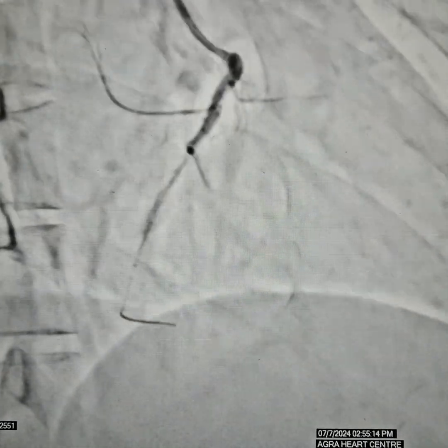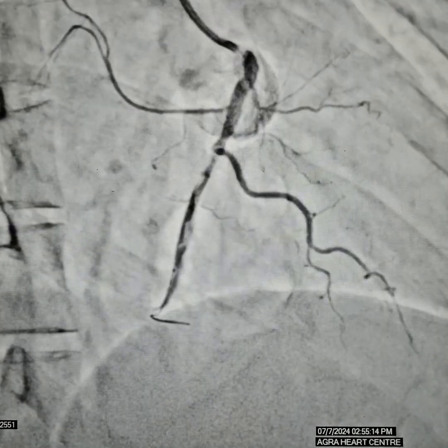There is a long stent that we have to take. Always measure stent length in at least 2 or 3 orthogonal views. This is an LAO cranial view right here. Multiple stent placement. The stent is inflated — go to the nominal pressure. Check again and go nominal again. Then ensure that the stent has been well expanded.